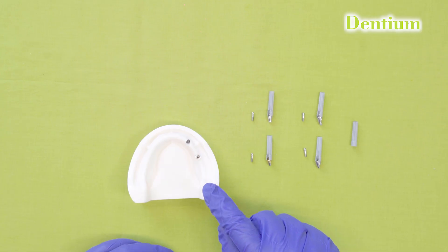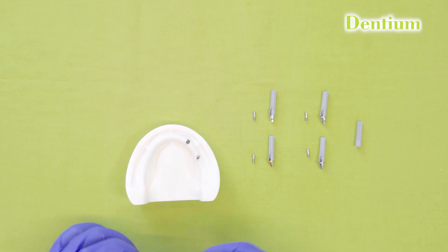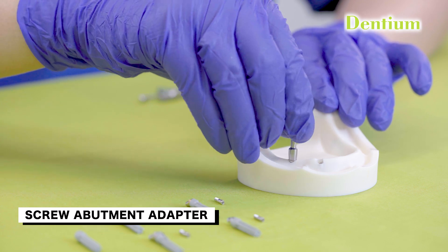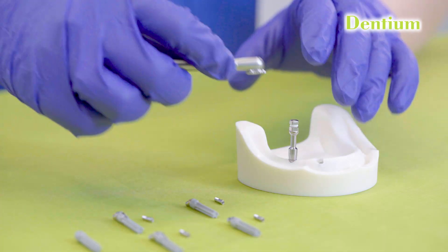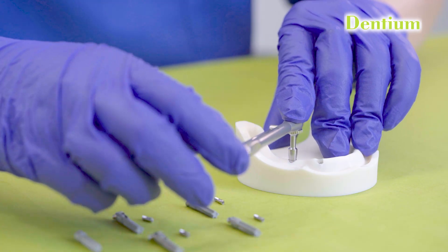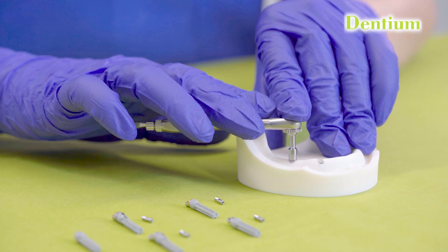After placement of the multi-unit abutment with the help of the delivery holder, it is fully tightened with the help of this adapter, which is present in the prosthetic kit. We will put this adapter over the multi-unit abutment, put the torque ratchet over it, and tighten it to the maximum torque of 35 Ncm.